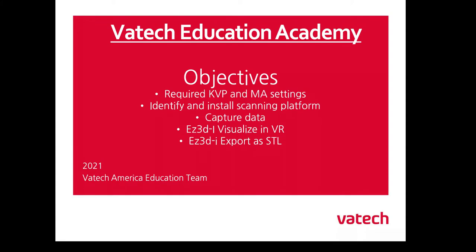Topics in this video include required KVP and MA settings, identifying and installing the scanning platform, capturing an object, EZ3DI VR settings, and EZ3DI export as an STL.